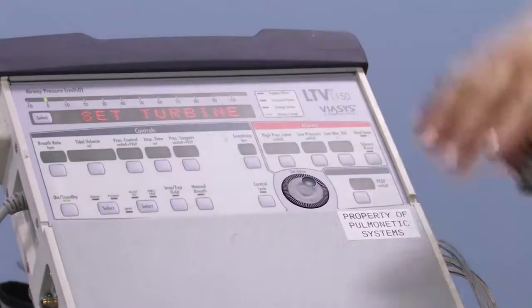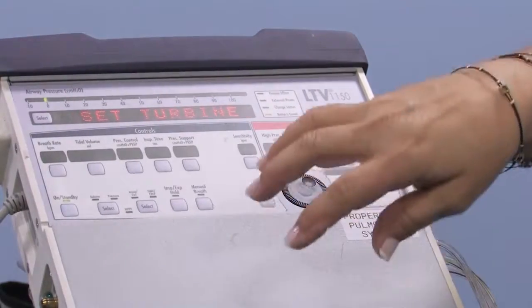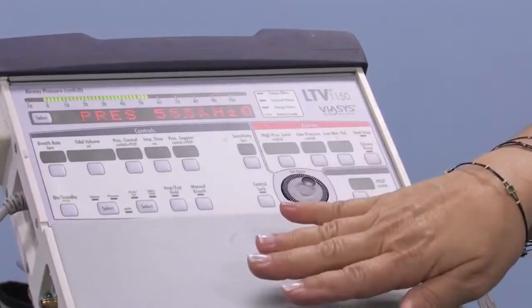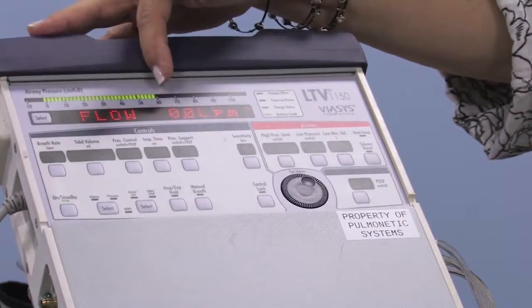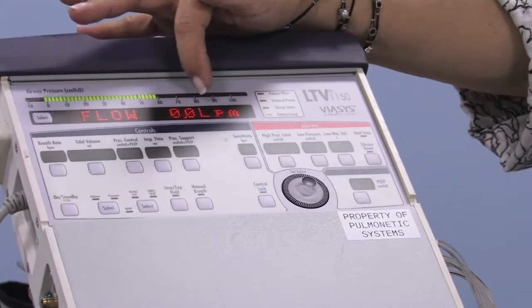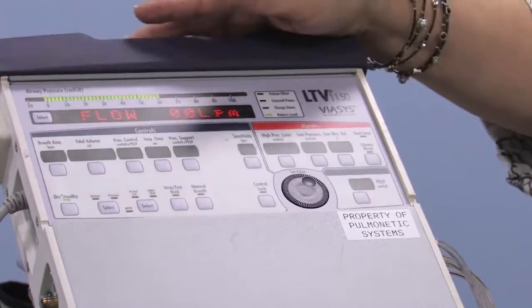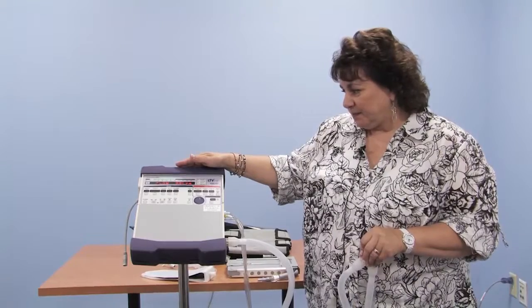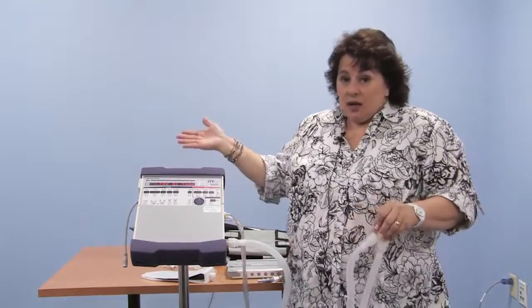It's going to look at its turbines. This runs hot in the front here. This is a special material that's used on airplanes to dissipate heat. Then it's going to do a pressure tightness test, usually in the 50 to 60 range, and it's looking for air leaking out. If we don't leak out 1 liter of air somewhere, we will pass. Leak pass. Good to go.